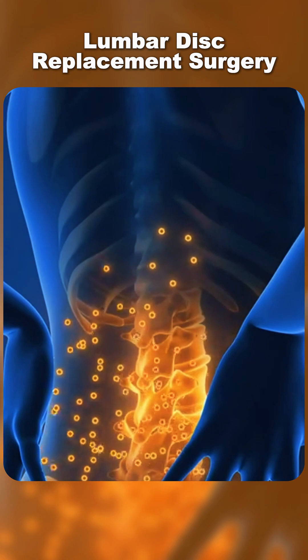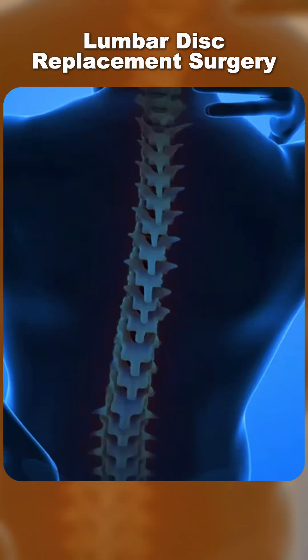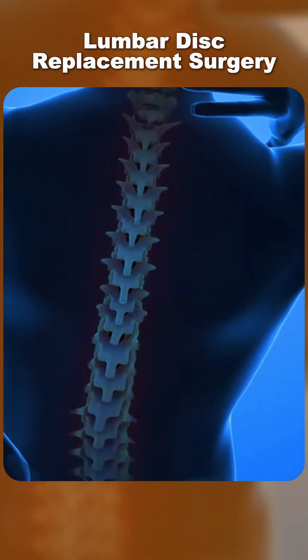Over time, patients often experience reduced pain, improved movement, and a quicker return to daily activities compared to fusion surgery. In short, lumbar disc replacement gives a worn-out disc a new life, restoring motion and relieving pain.